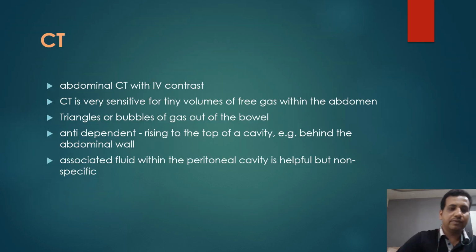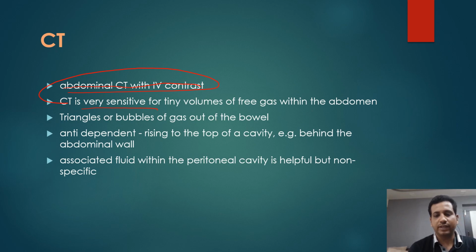So next comes the most important part, that is CT. Abdominal CT with IV contrast is the gold standard investigation. It is very sensitive even for tiny volumes of free gas within the abdomen.